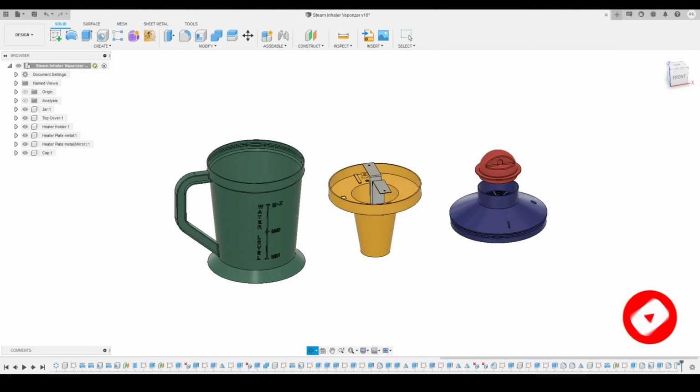And now I will define the rest of the measurements. So here you can see at the bottom the things are not looking very good now, so we had to adjust a little bit. So I will just drag a few of the lines and points to make the adjustment. Here you can see, and now I will define this bottom line as 50 millimeters again, and from this point to the bottom I had to define. So this distance from this point to the bottom is just 10 millimeters.